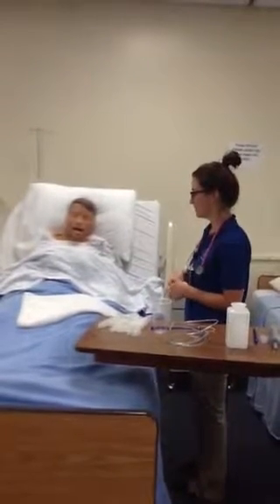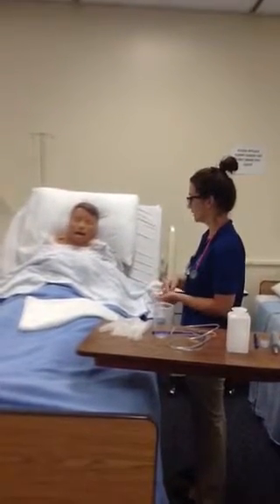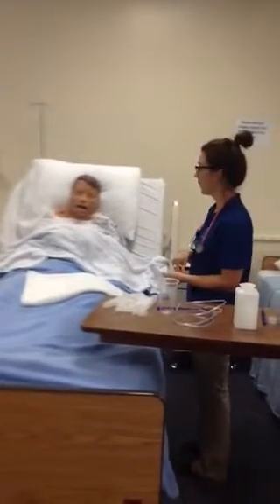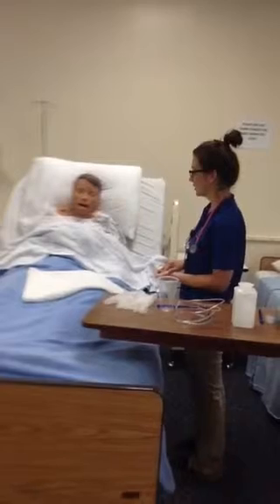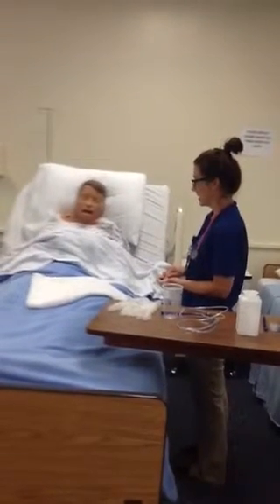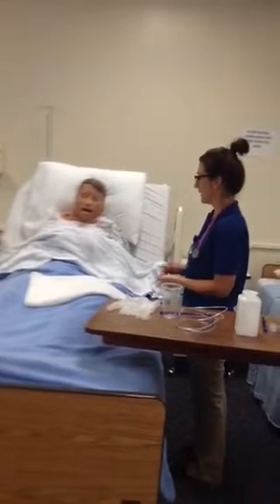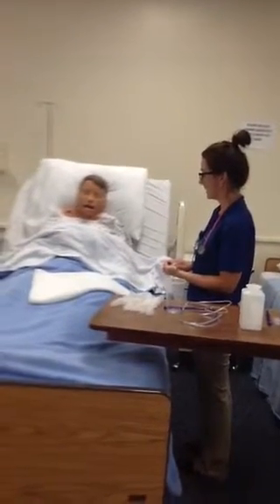And Mr. Wilson, your doctor has ordered the NG tube. Do you know what that is? I think so. He tried to explain it to me. Okay, well, we're just going to place a tube through your nose into your stomach and help get some of those secretions out of there that might be causing you some nausea and some pain in your abdomen. Is that okay? That's good.